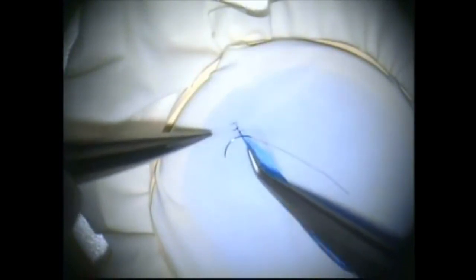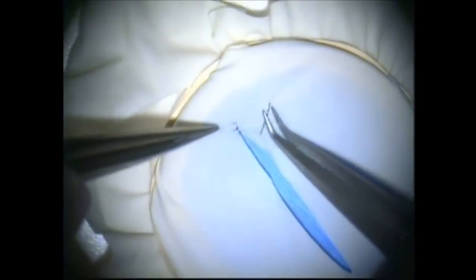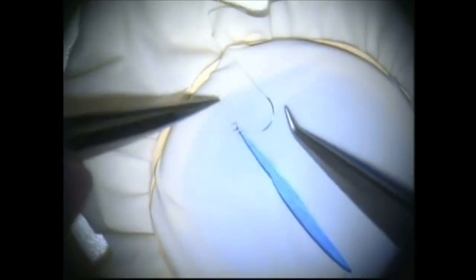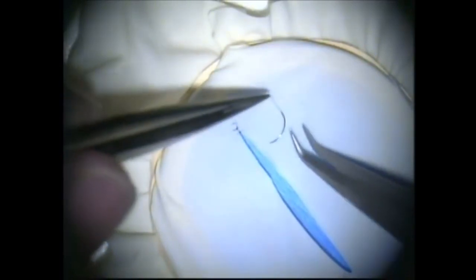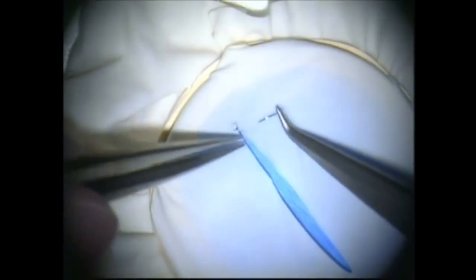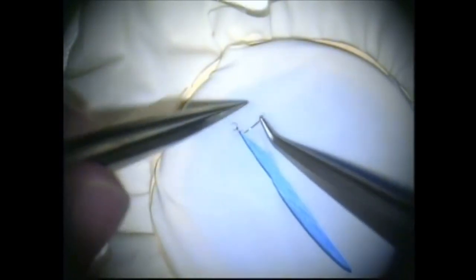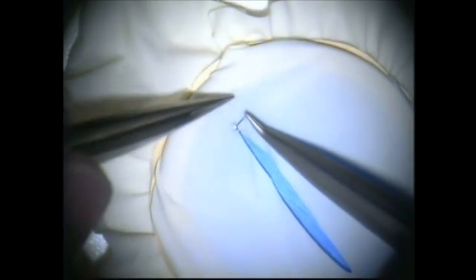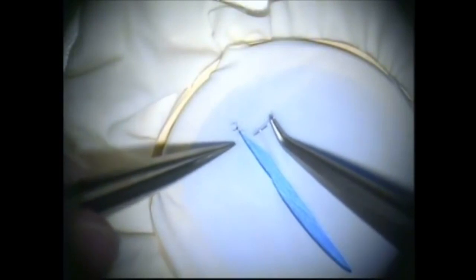The first step is picking up the needle. For the experienced microsurgeon, the needle can be grasped rather easily with one hand. However, when you're first starting, it's a very frustrating chore to pick up the needle. To simplify this, as discussed before, it's helpful to stabilize it with the end of the suture, and then the needle can be grasped about two-thirds of the way from the end. You don't want the needle too close to the tip of the jaws because it might easily jump out, so we want it a little bit back from the edge. Now let's go to suturing.